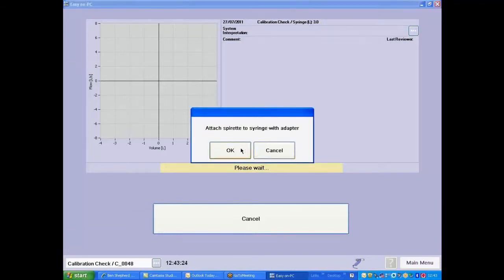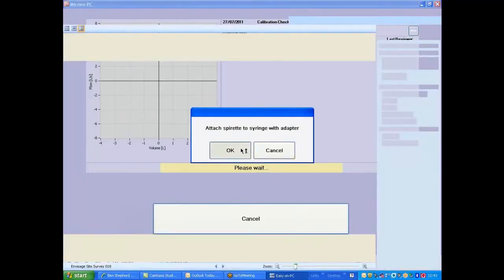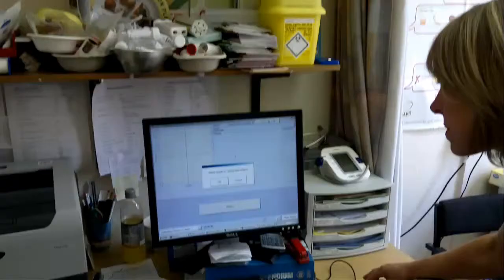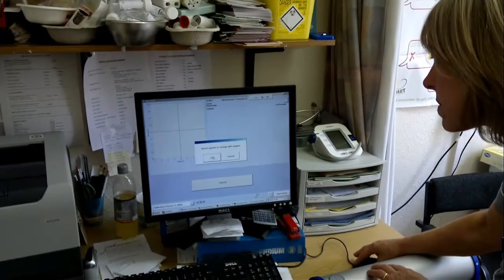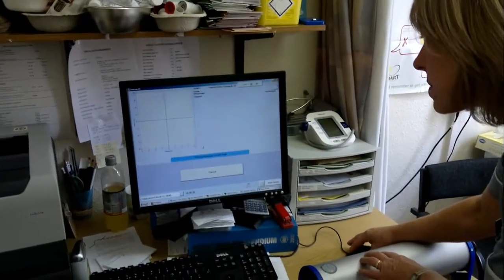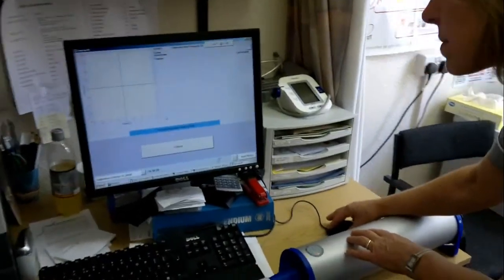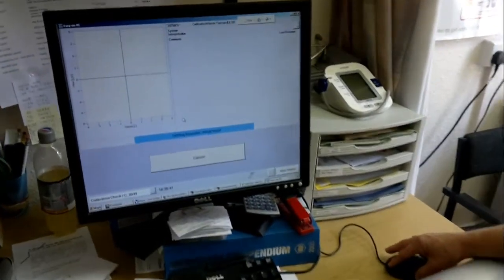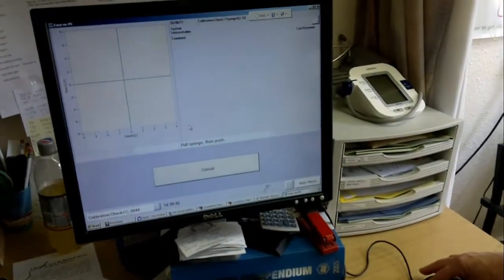The spirometer will now zero and we can now show you how the whole system works.